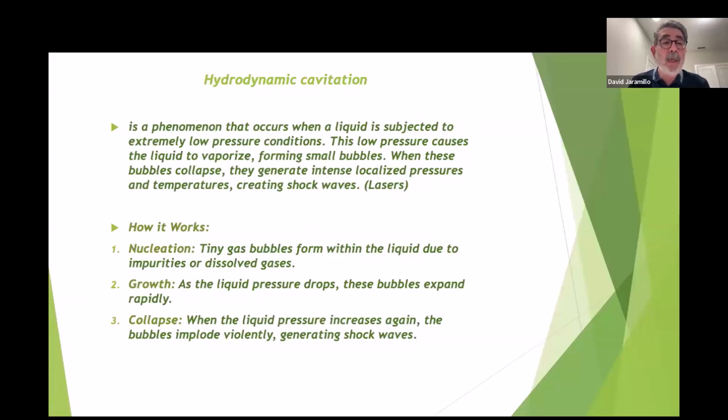This low pressure causes the liquid to vaporize, forming small bubbles. When these bubbles collapse, they generate intense localized pressure and temperatures, creating shock waves. So this is basically how the laser works, right? It is a matter of producing these gas bubbles.